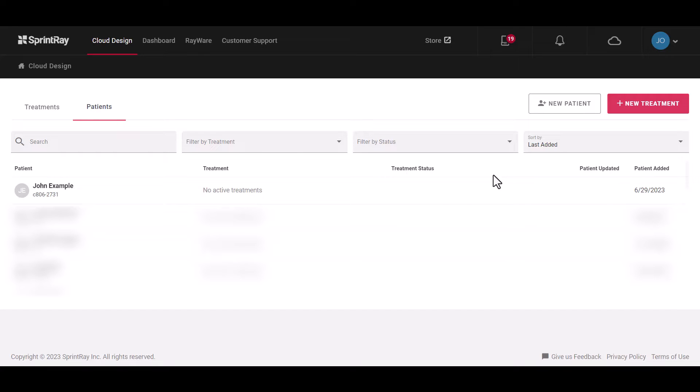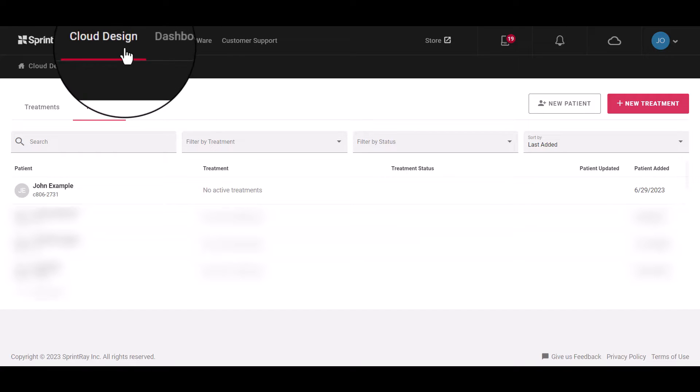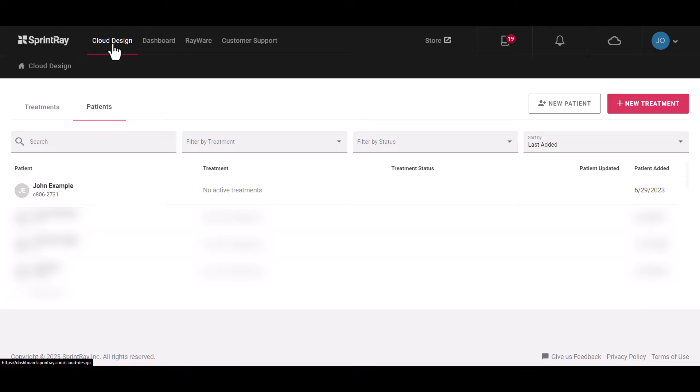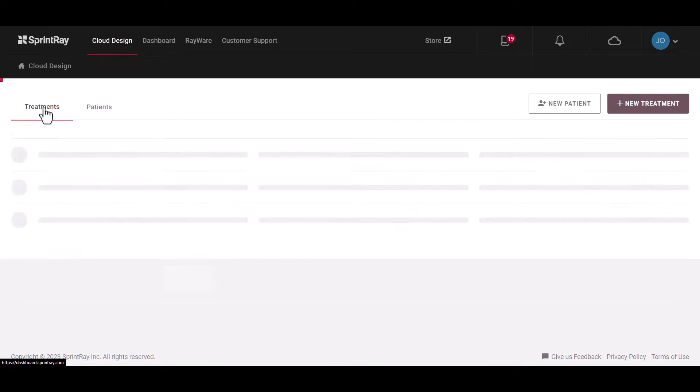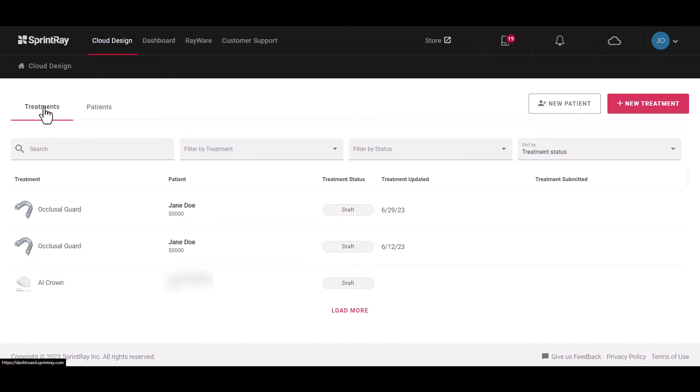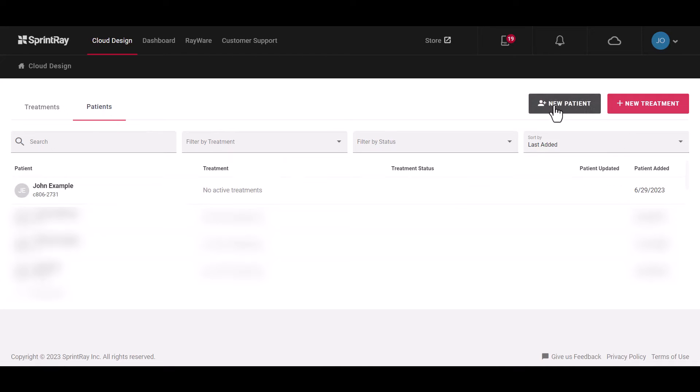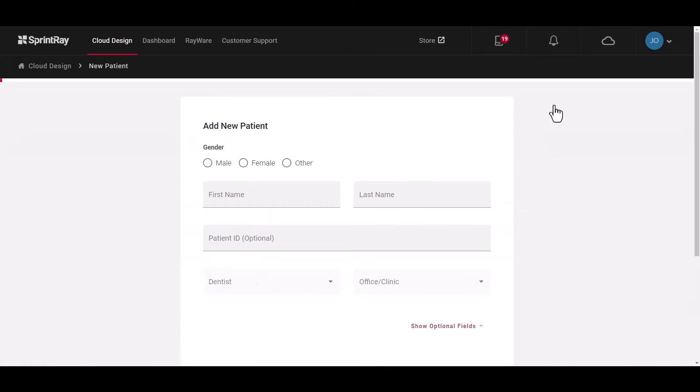Once you log in you'll see the new user interface which will default to either your Patients tab or your Treatments tab. These tabs will show the current status of your most recent submitted treatments or the most recent treatments submitted by patient.